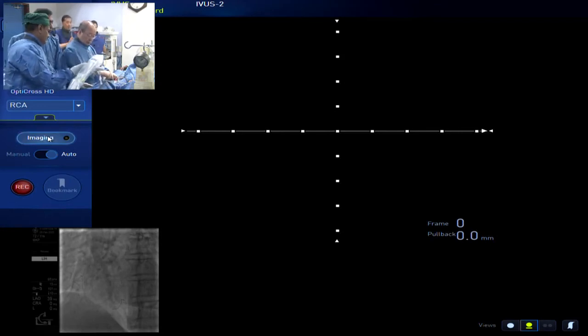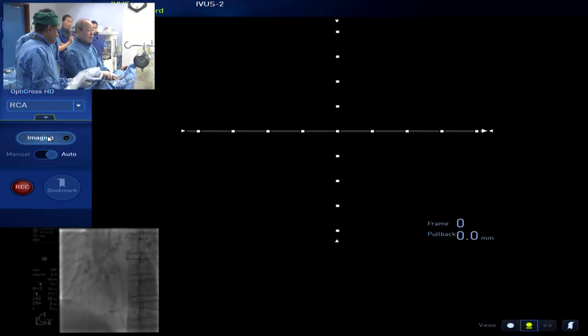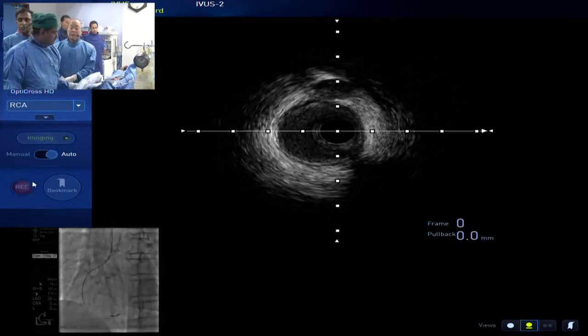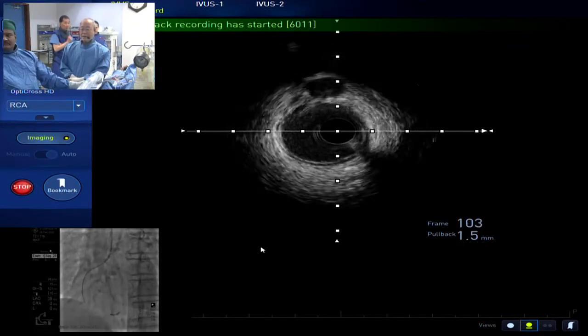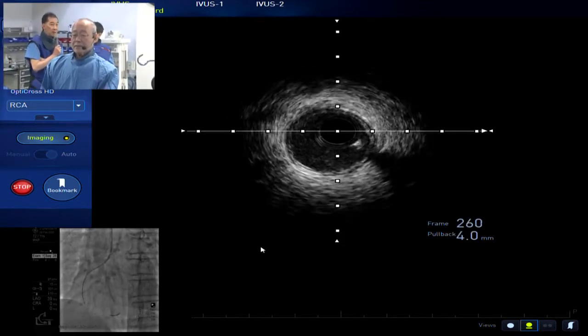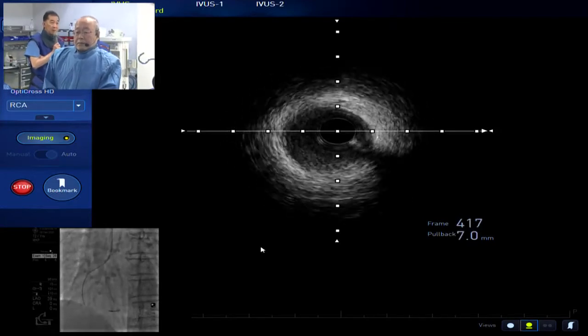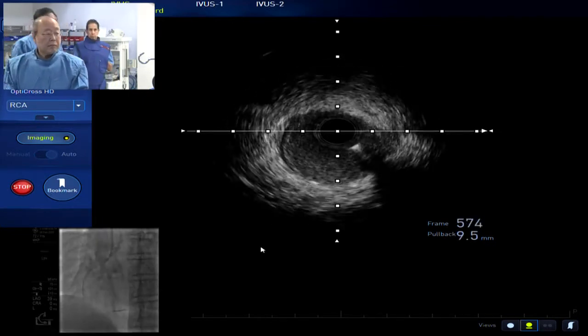I think it's a very, very good question. The late perforation, even though it's same day, we still monitor the patient regularly for at least 6 hours. So any perforation, within 6 hours, I think we can see it, even for CTO. So I don't know if it's really worth monitoring the patient overnight or same day discharge. For some patients, I do a lot of bilateral radial, and with bilateral radial I have more reason to send the patient home same day.